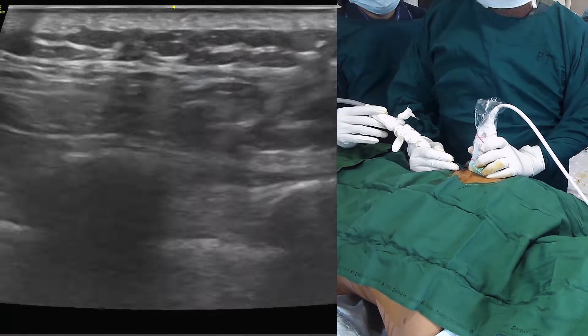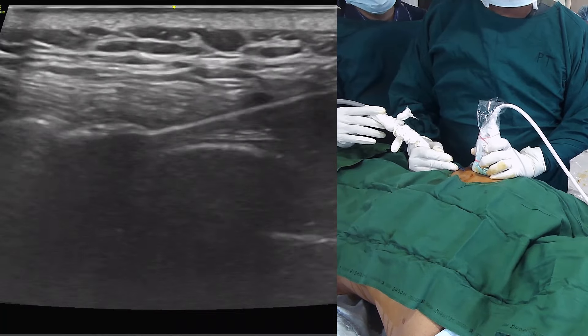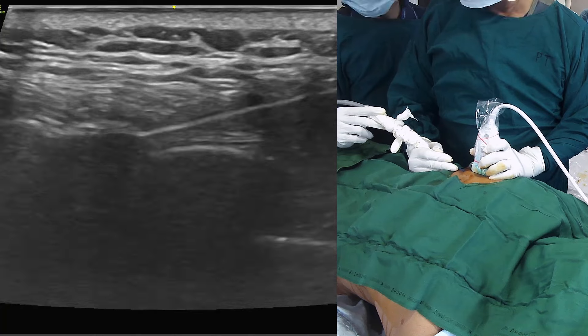The size of the ice ball is approximately 8 mm in length and 6 mm in width. Freezing for 3 minutes is followed by thawing of 1 minute. Then the cryoprobe is withdrawn.